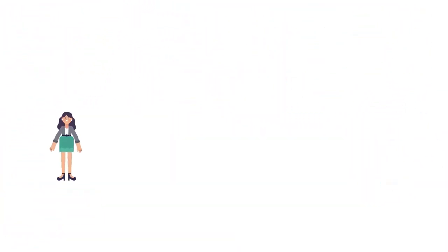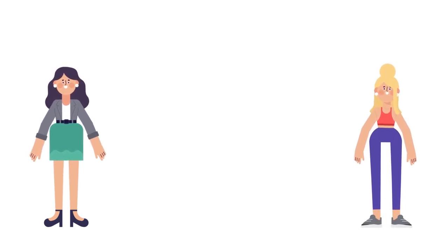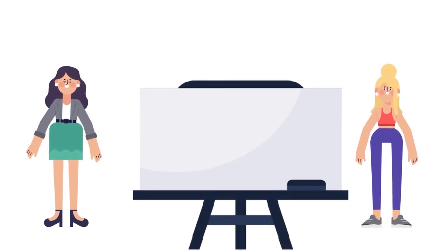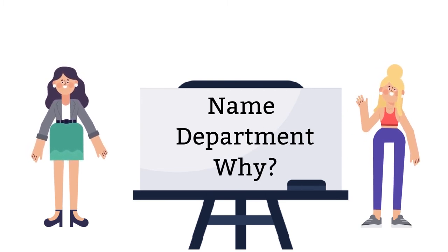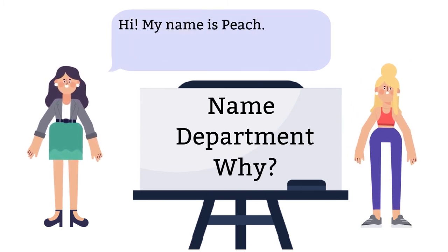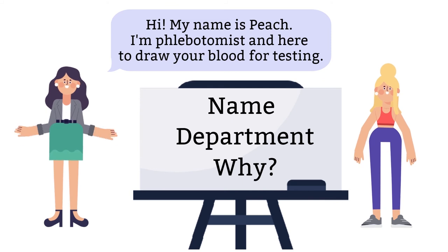Before you can perform a procedure on patients, regardless of what it is, you'll have to identify yourself, tell the patient who you are, what department you are from, and the reasons you are there. For instance, my name is Peach, I'm a phlebotomist, and I'm here to draw your blood for testing.